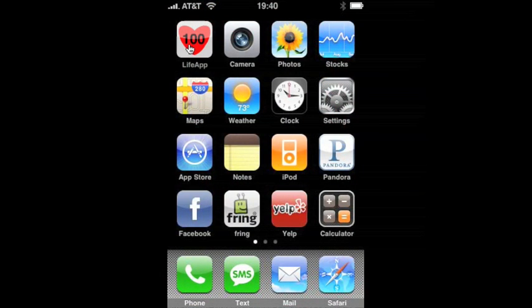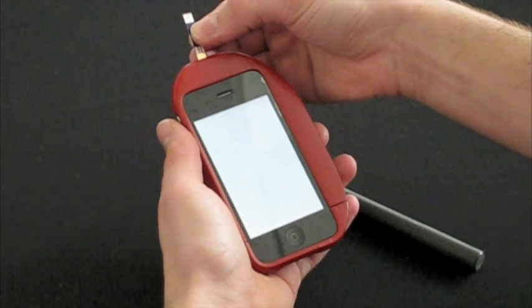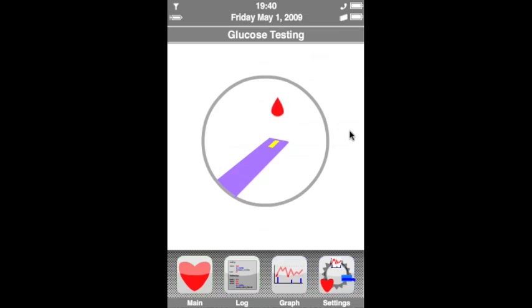LifeApp for the iPhone facilitates unobtrusive diabetes management. The main screen displays the user's most recent blood glucose and active insulin levels. To test blood glucose, users insert a test strip into the slot at the top of the case, which brings up the testing screen, and then test as usual.